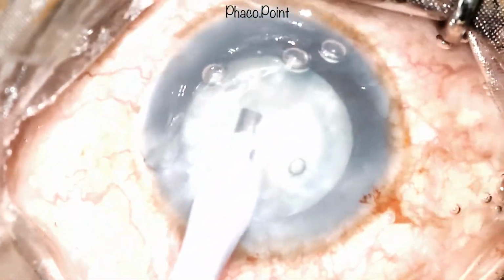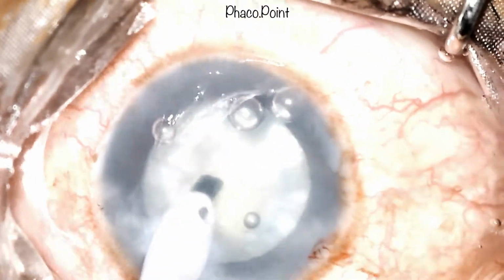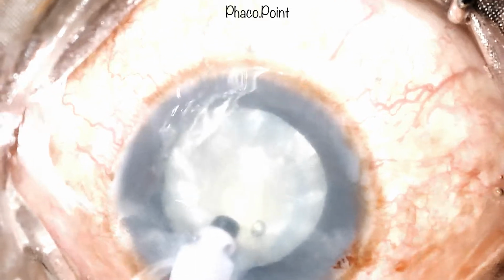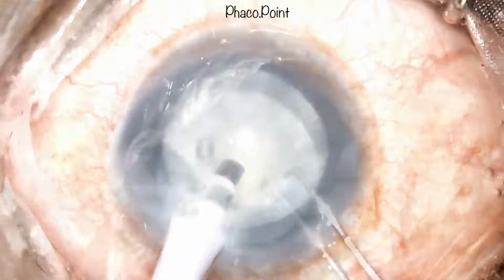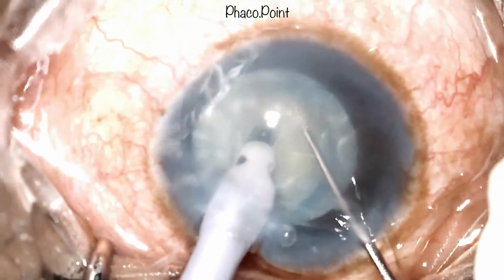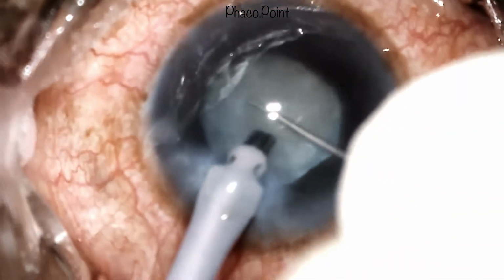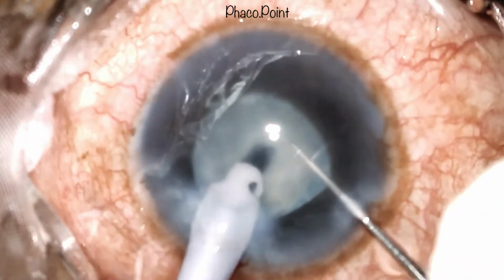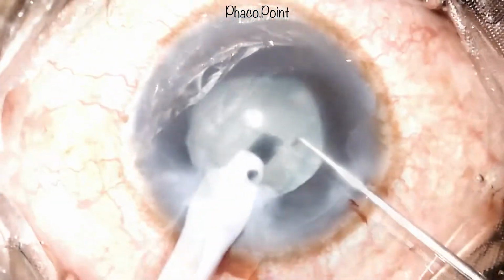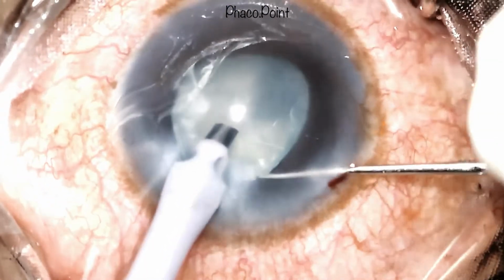We now proceed with phacoemulsification using the direct chop technique. I like the Kelman mini flare tip. I like the downward angulation that comes about 22 degrees, which very naturally places the tip at a slightly downward position. The settings that I use are a power of about 30 to 35%, a vacuum of 350 millimeters of mercury, and a flow rate of 35 to 40 cc per minute. The technique being followed is the direct chop technique, where the nucleus is impaled by the phacoprobe.